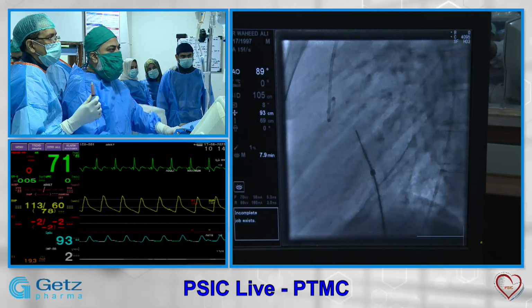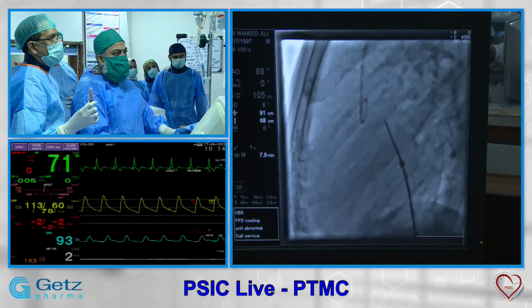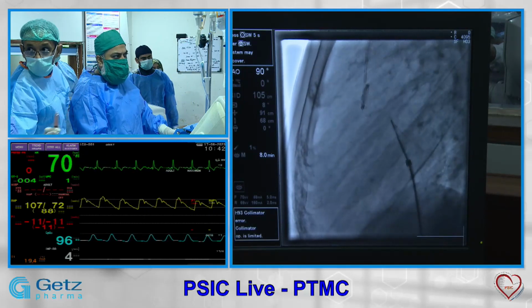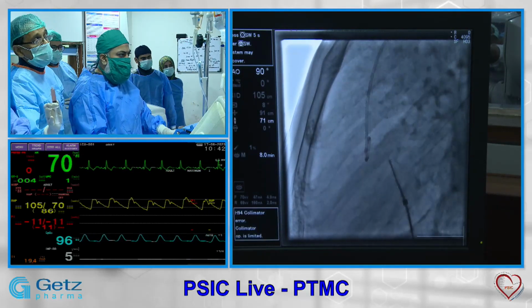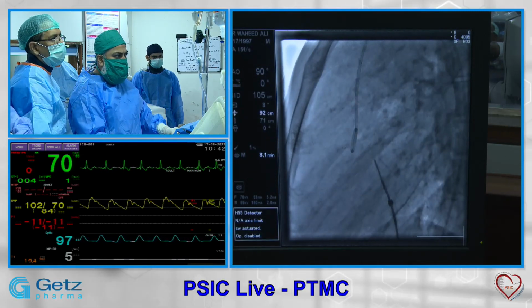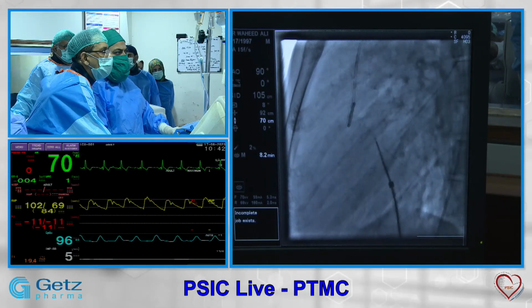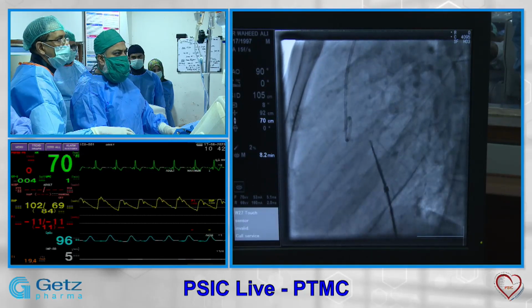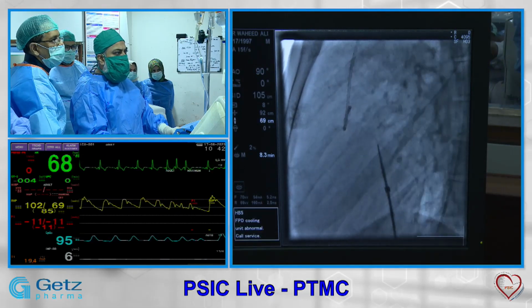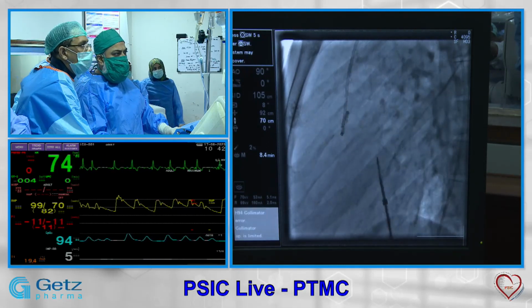Center please. Okay. So if I puncture here directly, I'll go into the aorta. So my aim will be, just for the fellows, please center, show lower. Table up, yes please. Center a little more. So in this one, you see, if I puncture here, I'll go into the aorta. So what I am doing is, I'll try to pull back and rotate 4, 5. Give it please.